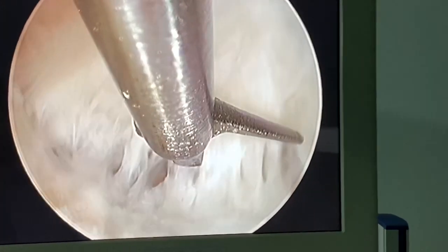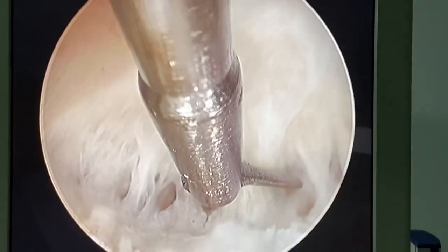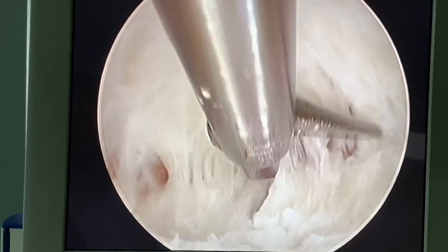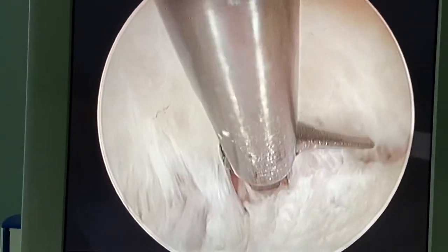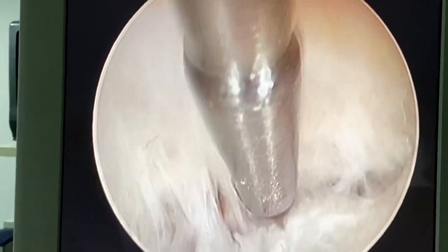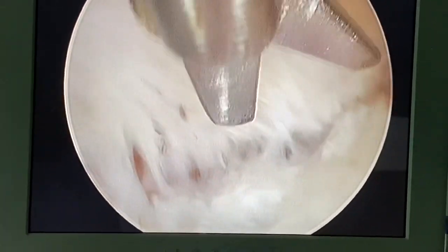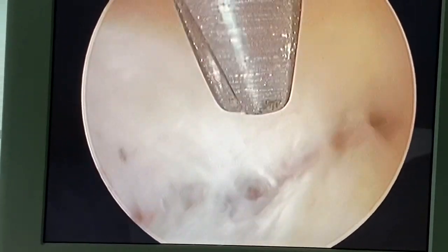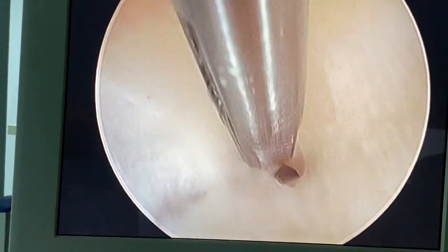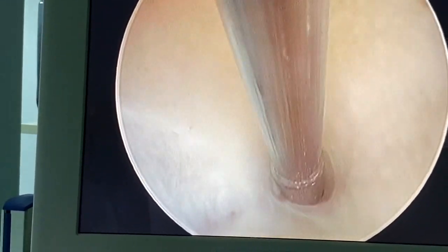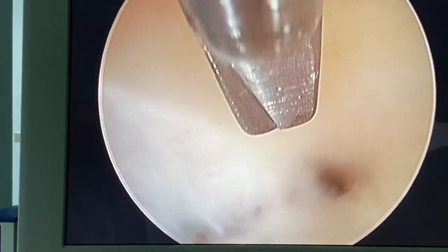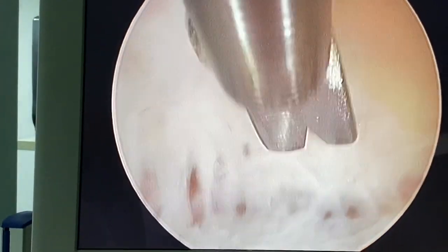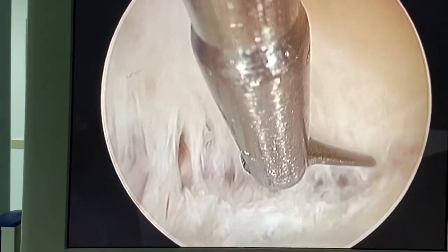These are the fibers of the fundus. Be careful here because it was already attempted before — not by myself — for the septum, and not fully removed. This is one tubal ostium. I can see there is some depth, so a very little cut is needed. You have to be like a microsurgeon.